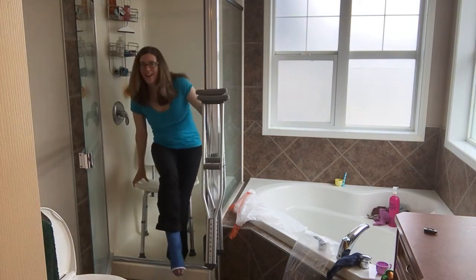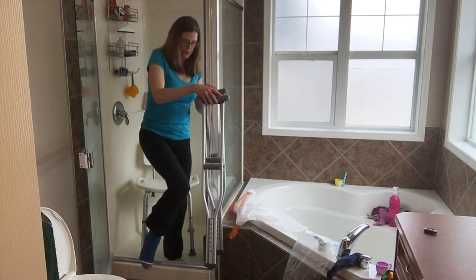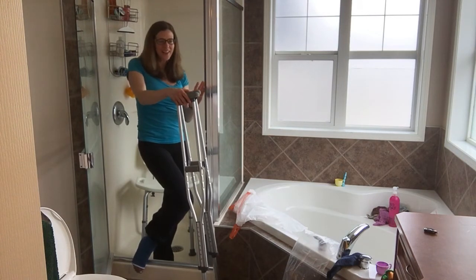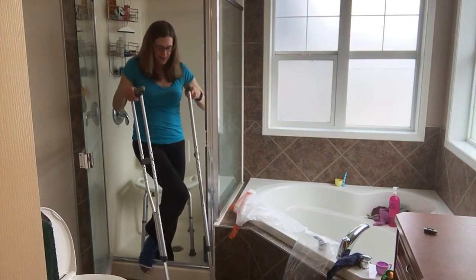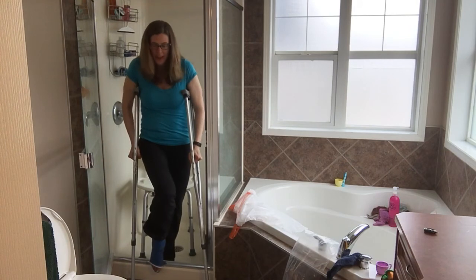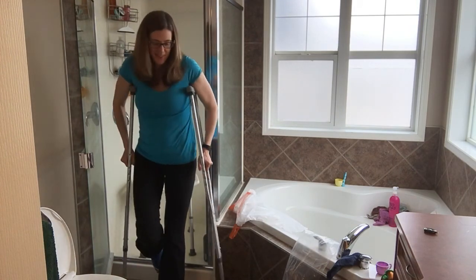I turn around and then I sit down — that's all there is to it. I'm not going to sit down right now because it's still wet from my shower this morning. Getting out is just the opposite. Make sure you have your towel handy — I've made that mistake — because you want to dry yourself off so you're not slippery. Then you use your crutches on the outside again and just step out. That's all there is to it.